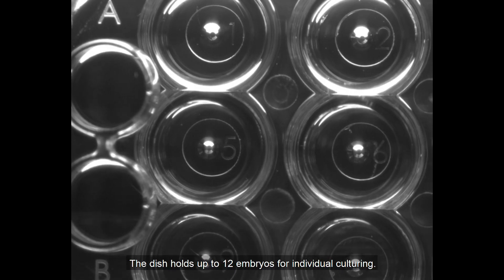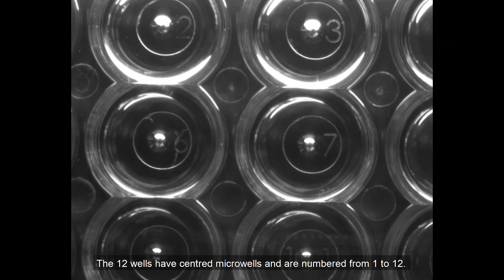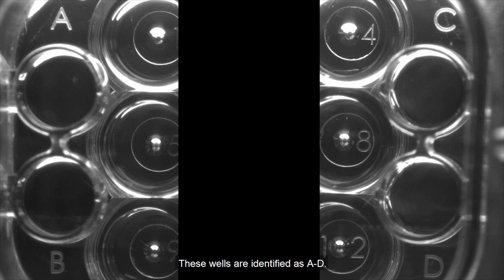The dish holds up to 12 embryos for individual culture. The 12 wells have centred microwells and are numbered from 1 to 12. It also has two rinsing wells at each end of the dish for use during embryo handling. These wells are identified as A to D.